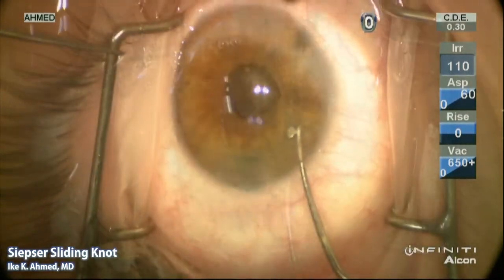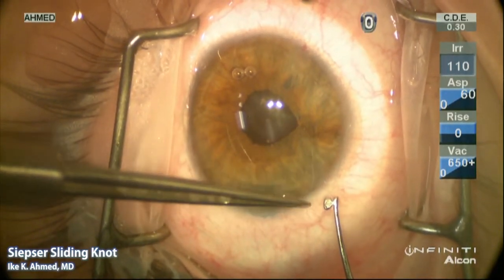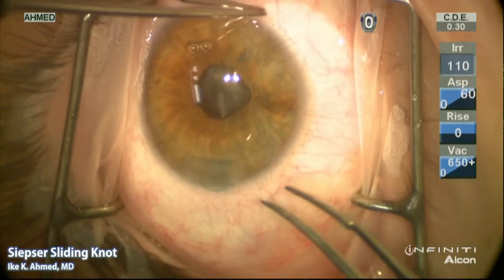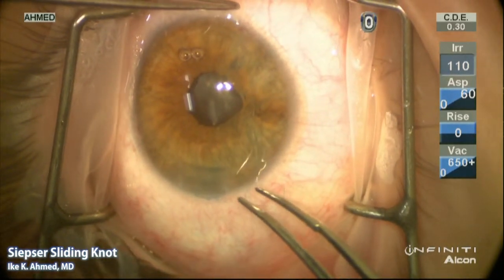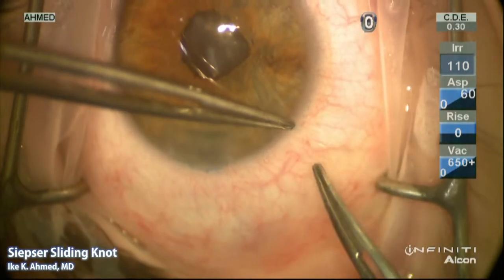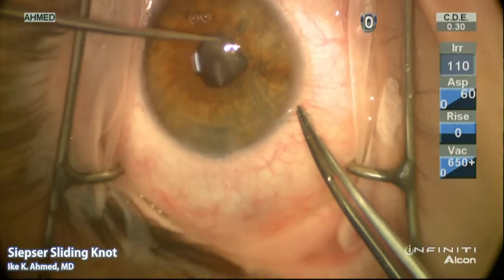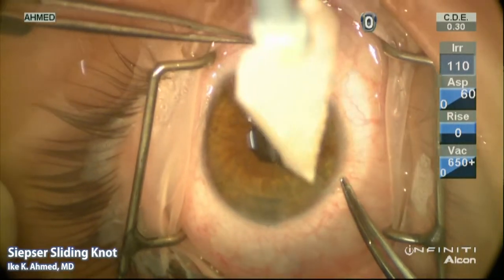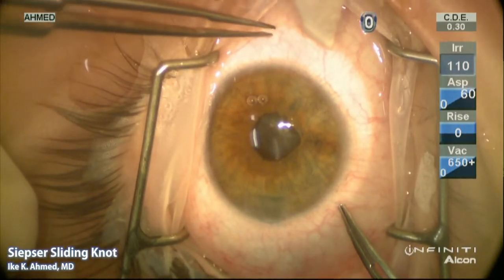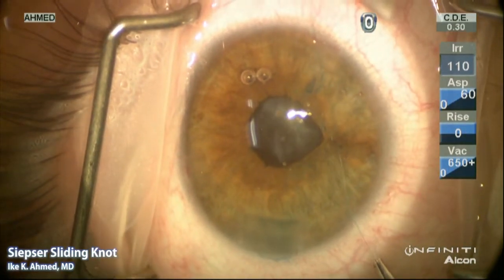The Kugeln hook is then used again to create a loop of the distal strand emerging through that proximal paracentesis. We see the loop adjacent to the proximal strand. It's important to ensure that the distal strand is still visible through the distal paracentesis. Now we do a reverse single throw of the distal loop, grab the proximal strand, and the distal strand is pulled to slide the distal loop along the proximal strand, tightening and locking the suture in place. The lock is important to ensure a secure knot.